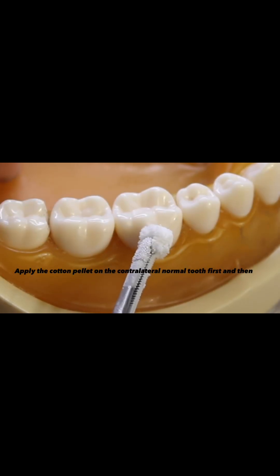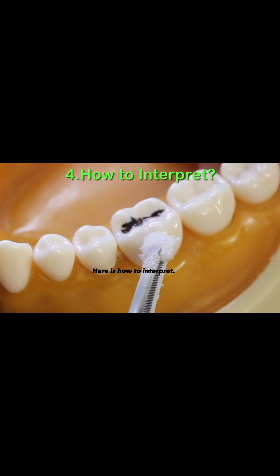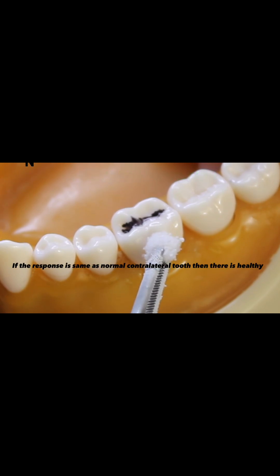Apply the cotton pellet on the contralateral normal tooth first and then test the suspect tooth. Here is how to interpret: if the response is the same as the normal contralateral tooth, then there is healthy pulp.